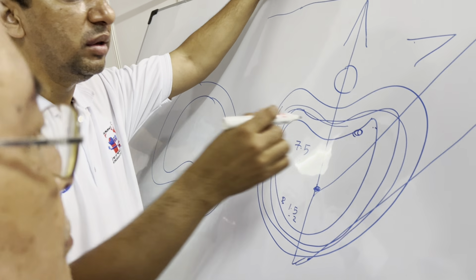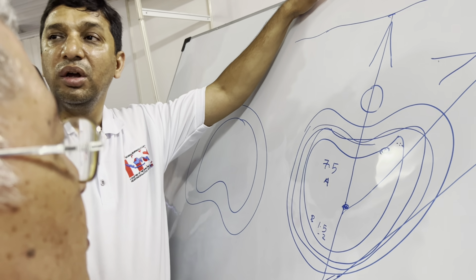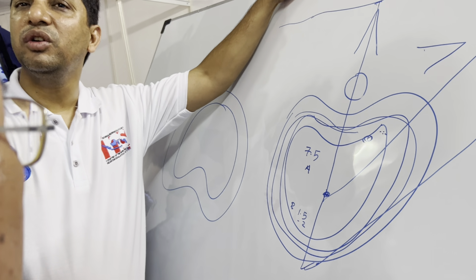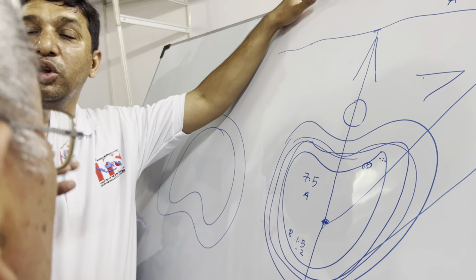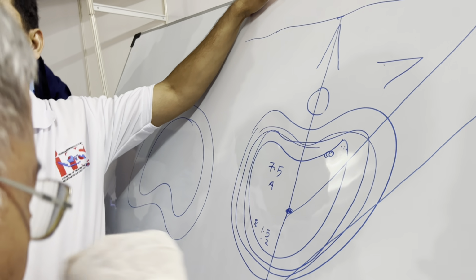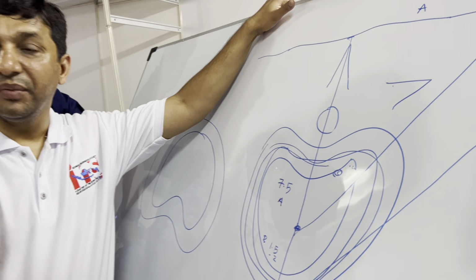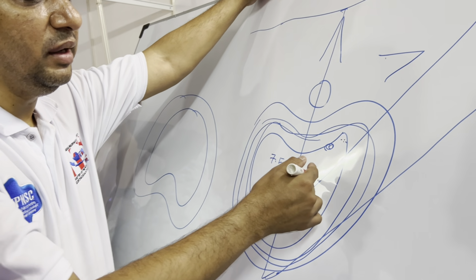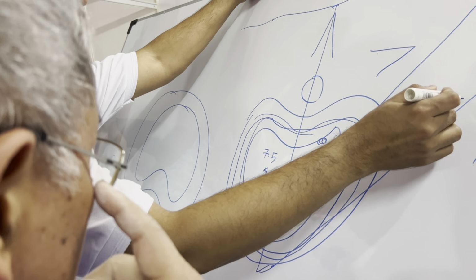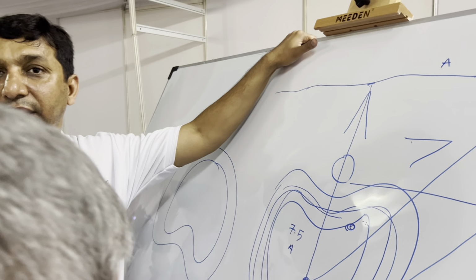When you reach the subannular area, you go inside the disc. Inside the disc is avascular and non-neuronal, so you are not going to have bleeding or nerve injury. You are perfectly fine, and then you just have to remove the fragment. When you go inside the disc, it is called the inside-out technique. When you remain in the epidural space and just remove the tip of the herniation, it is the outside-in technique.